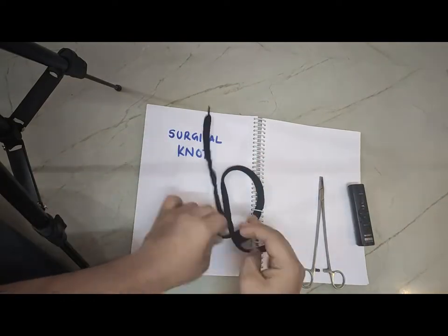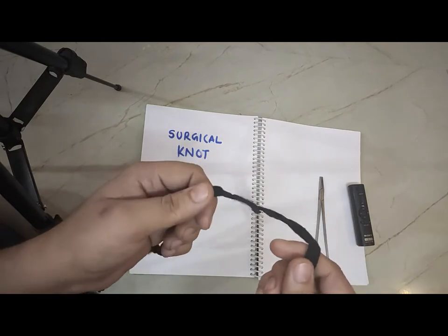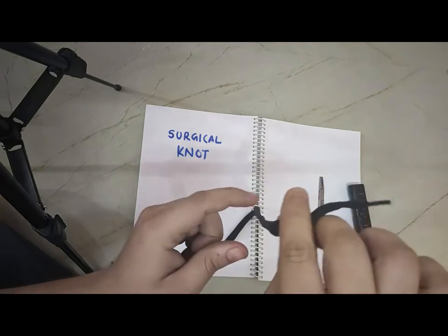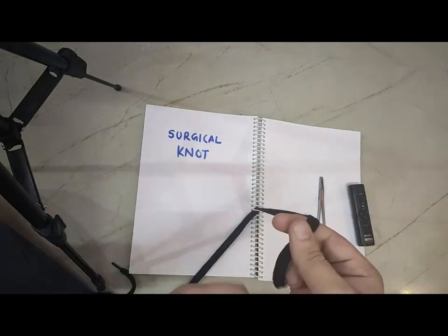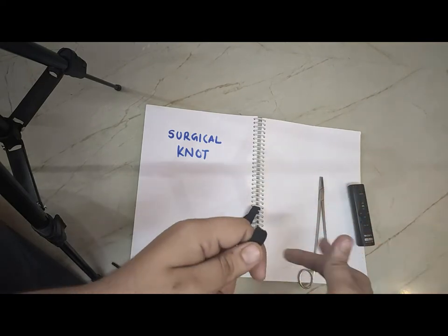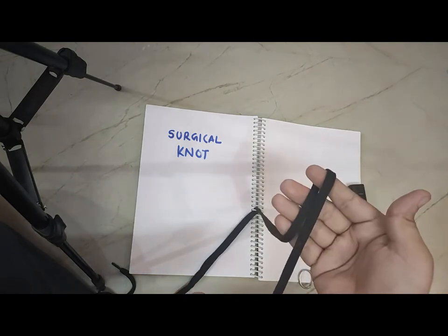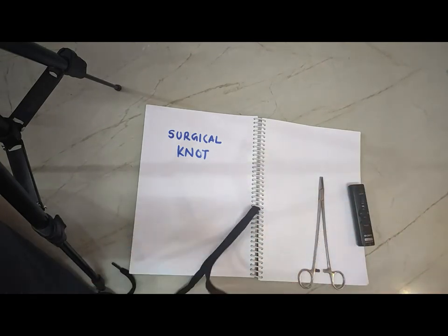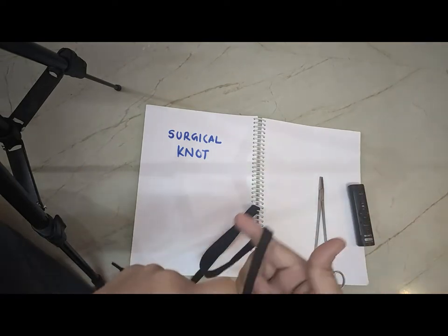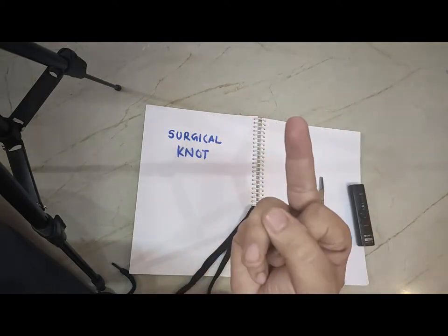You have to be very, very quick. One end you should hold like this, and the other you should hold like this. Now, which finger will work together? The middle finger.